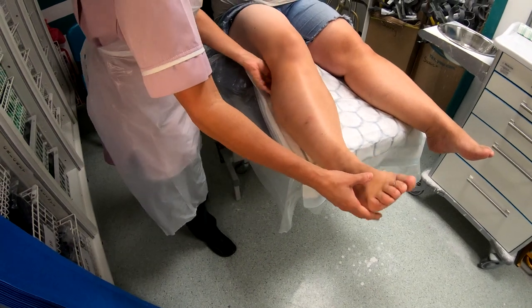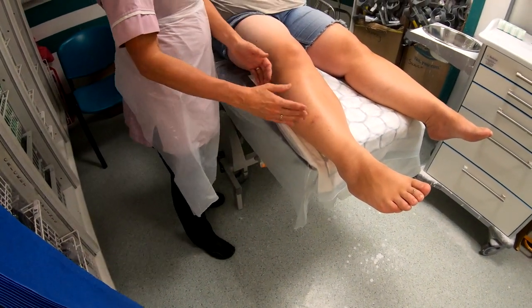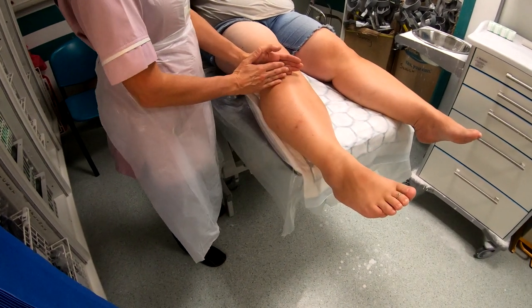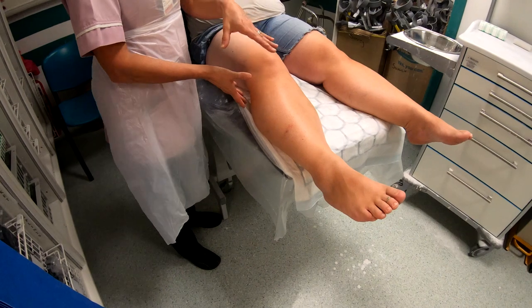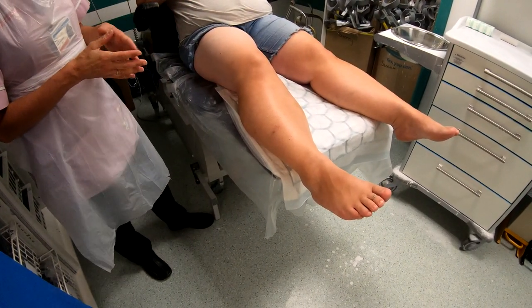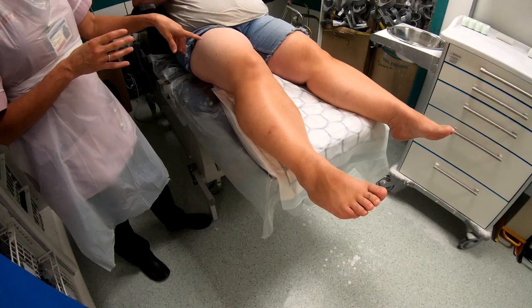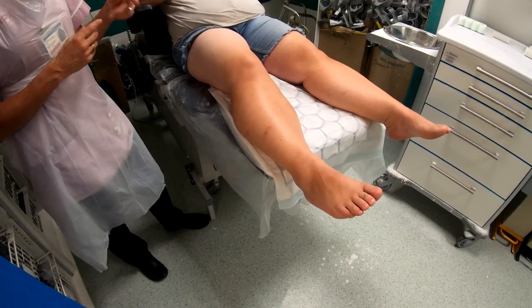So it's perfectly fine to do this in two halves. We're going to cut out the below-knee plaster first and have that ready to go — that's exactly the same as what we did before with the below-knee backslab. What we will do first is put the stocking net on for the whole leg and the soft band as well, and then the actual plaster cast.